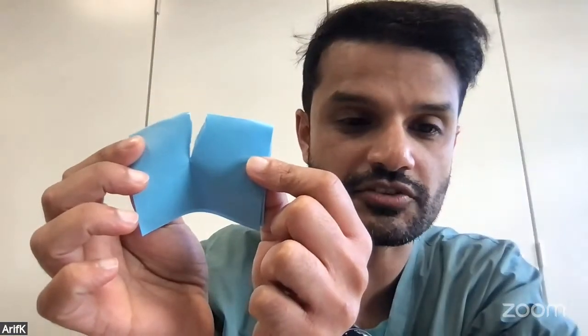Yeah, sure. Maybe the simplest way would be to explain it like this rather than getting fancy. Let's pretend that this sticky note is a leaflet. Can you see that? Yes, I can. Very simple. Basilica is this. You just make a splice in the leaflet. That's it. You cut through. You can eventually have a look at all the equipment and things we do, but basically, all Basilica does is create this little splay in the leaflet. Now, contrast that with, I'm sure Ollie won't mind me using all his sticky notes here, contrast that with Unicorn.